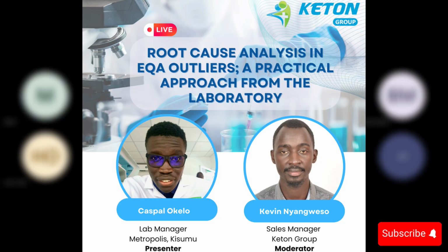There are labs that use manufacturer-provided means, but as a standard good quality practice, you use manufacturer-provided means for a defined number of runs, mostly 20 runs, when you have a statistically significant sample population. After your 20 runs, you have your calculated mean, or what we call cumulative mean. So after 20 runs in your IQC, you'd use your calculated means. Before that, you use your manufacturer-provided means.